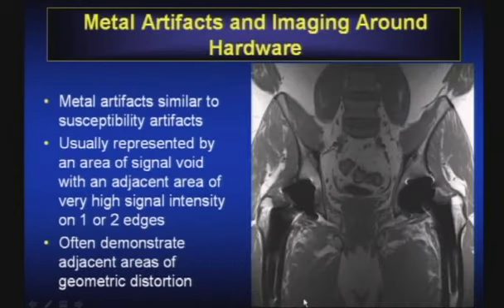Okay, well, in the last 15 or 20 minutes, what we're going to focus on is imaging around metal hardware, or orthopedic hardware. And again, we're going to add these images to a PDF that will be emailed to all of you. So you're at an advantage, I guess, in that you get to be very interested in these topics and have to wait until you get home to look at the hard copy.